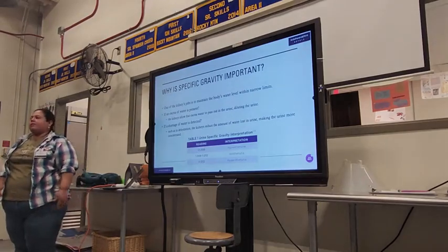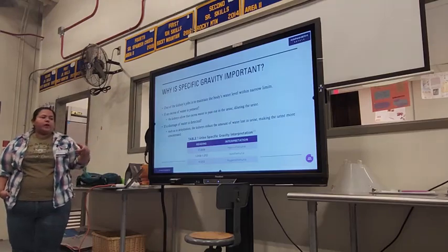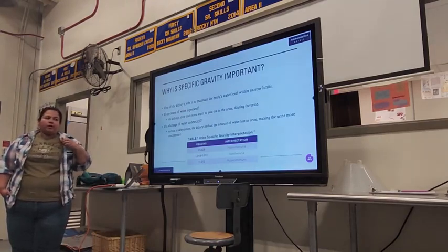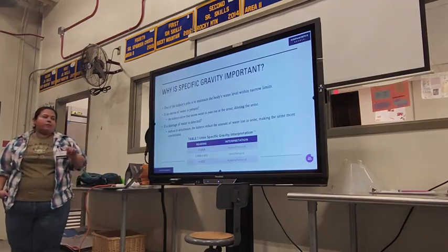I can't pronounce it, whether I try to do it slowly or not. If it's between 1.008 and 1.012, it's isosthenuria. Typically that's a little more within the normal range, right? It's only a 4-point difference there.